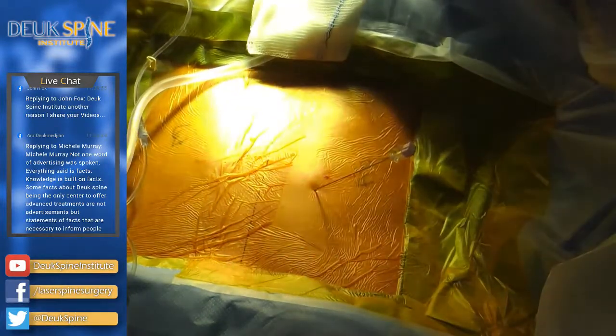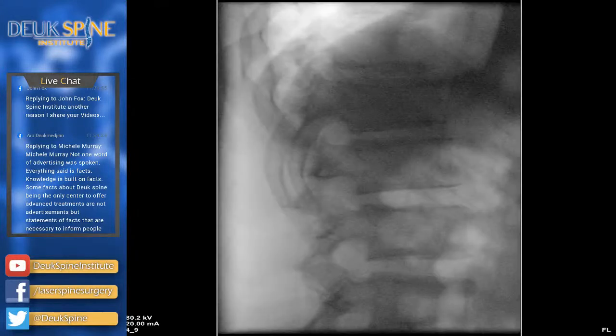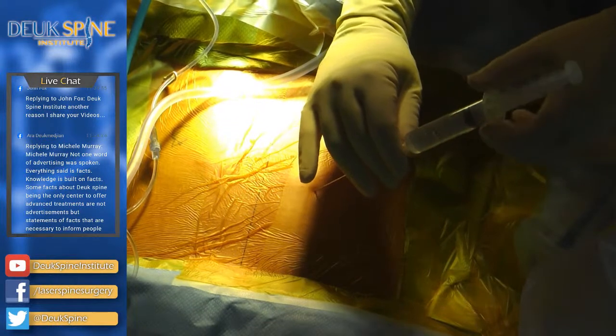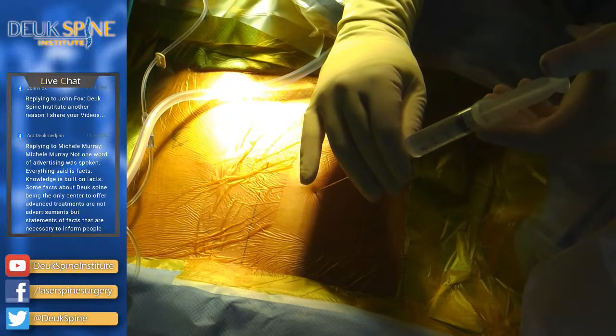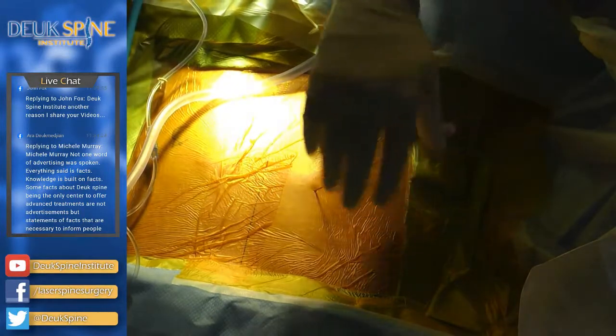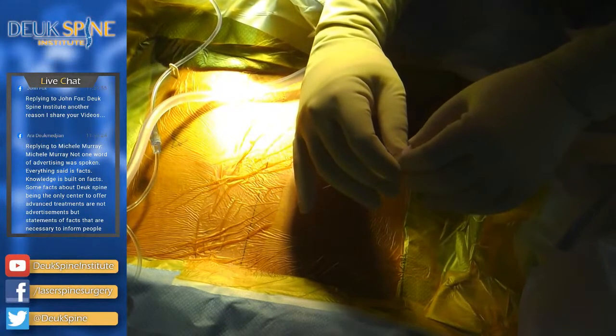Sean? I'm going to just give him a little bit of numbing medicine. Are you comfortable? All right. You're doing great. Just lay still and breathe nice and slow, and that's perfect for helping me, okay? So, just like with the lumbar spine, we're going to access the disc through a transforaminal foraminal approach.